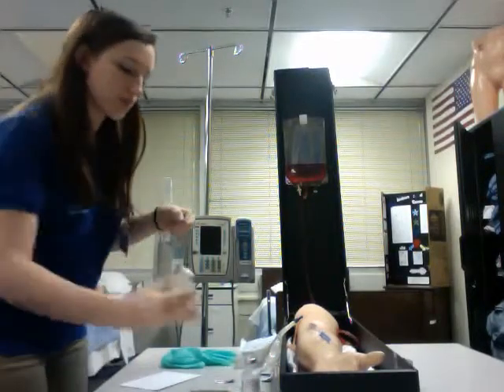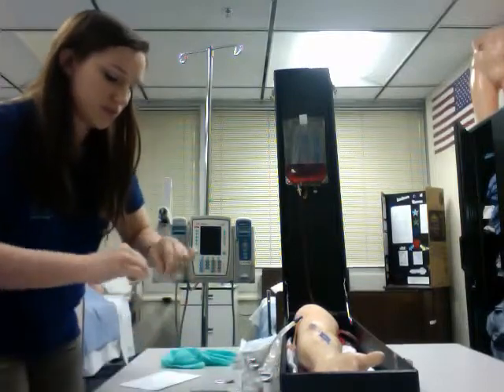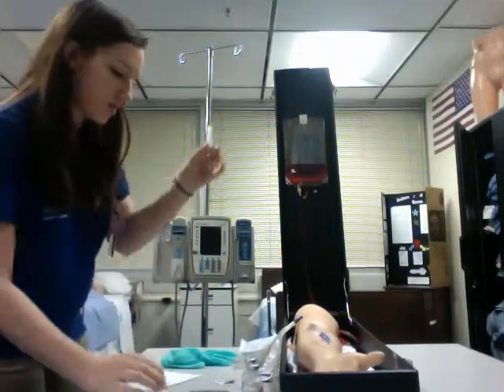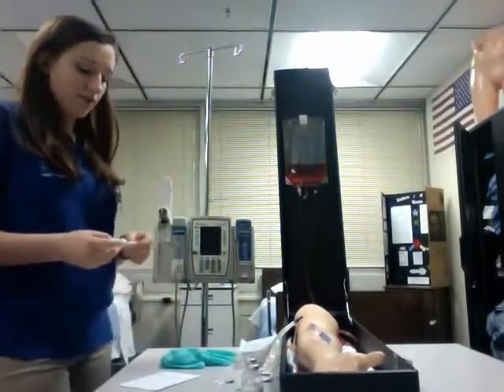Okay, I have my normal saline ready for the flush. I'm going to discard this needle in the sharps container. So this is all set. And now I'm going to draw up half a milliliter.